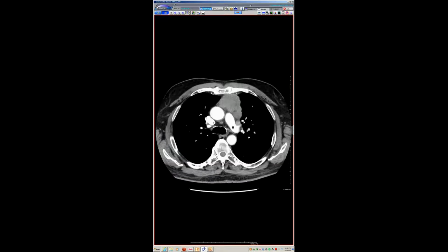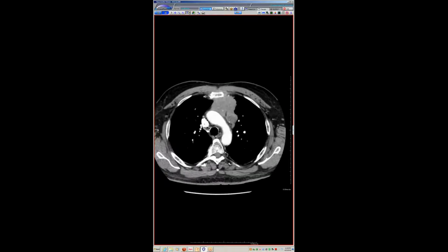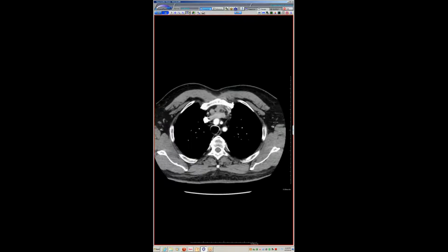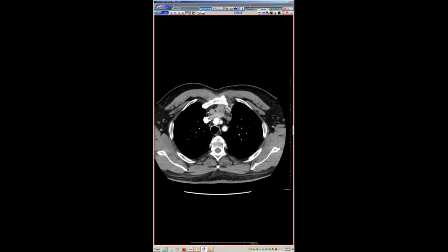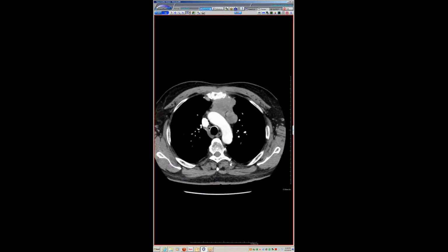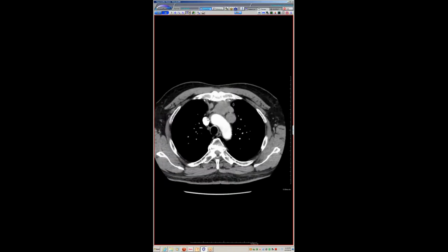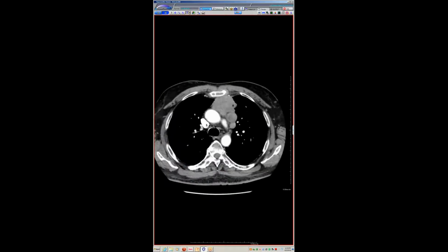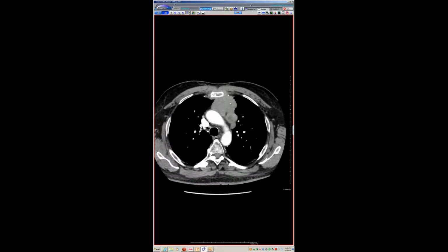This is a 45-year-old that came in with relatively low-grade bladder cancer, and had this anterior mediastinal mass. It had multiple surrounding lymph nodes. It was going into the chest wall a little bit, and no other disease, nowhere else in the whole body. So just a bladder cancer that wasn't super aggressive, T2, and this thing, and I really thought, he was 45, could this be germ cell tumor? Could it be lymphoma? It's not typical for thymoma given the lymph nodes around it, but it's possible. But anyways, this was biopsied, and it was metastatic urothelial cancer.